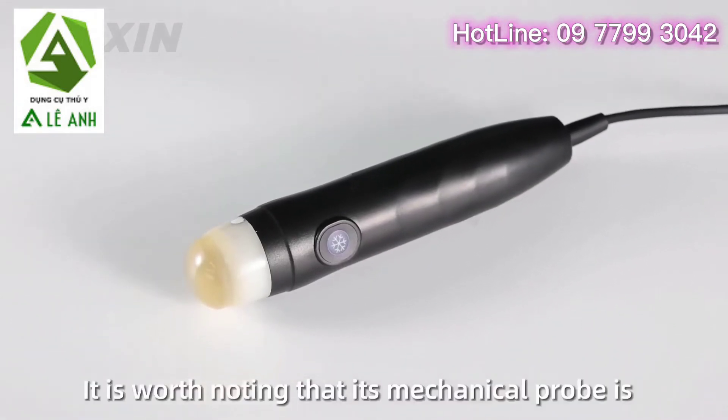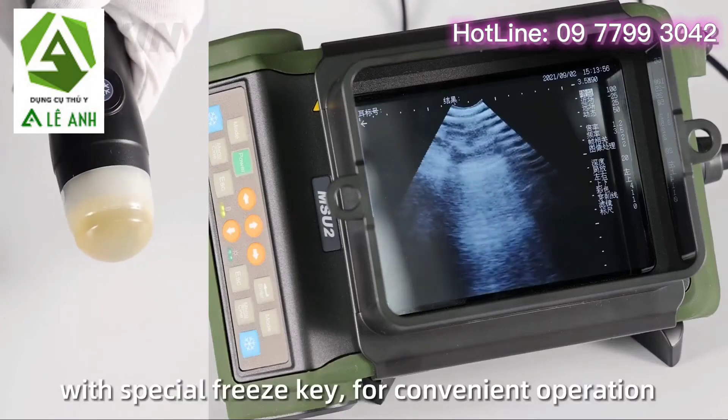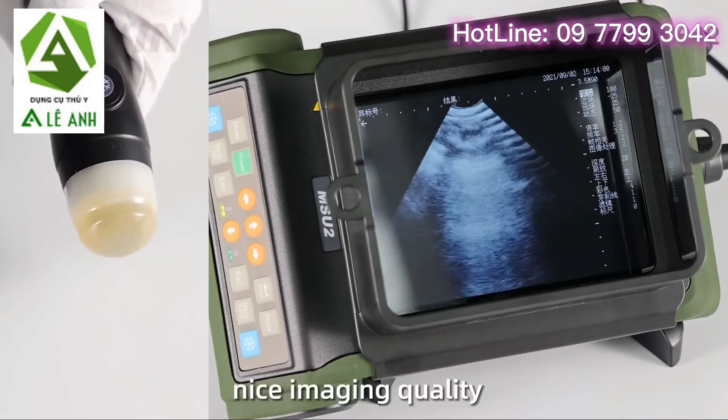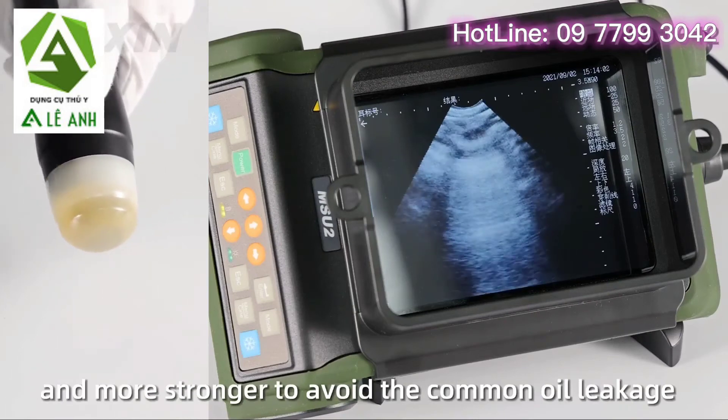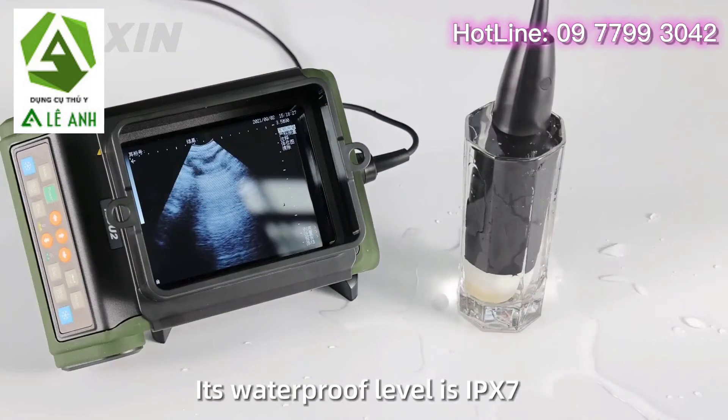It is worth noting that its mechanical probe is a more comfortable handheld size with a special freeze key for convenient operation, nice imaging quality, and stronger construction to avoid common oil leakage. Its waterproof level is IPX7.